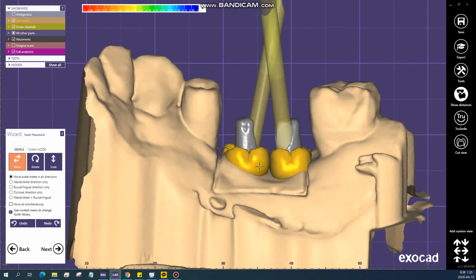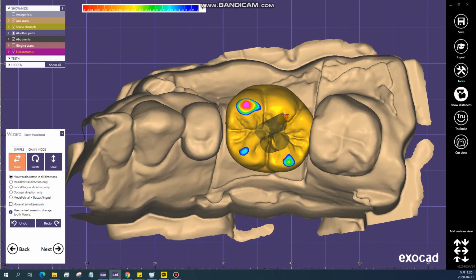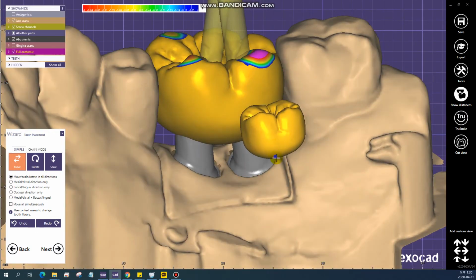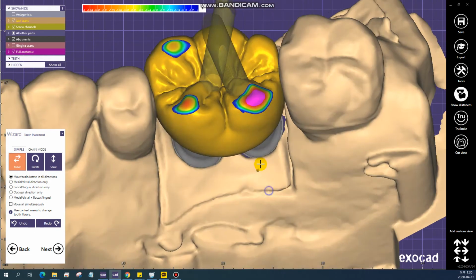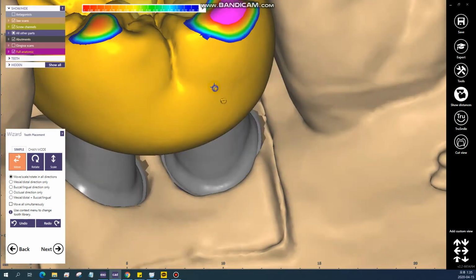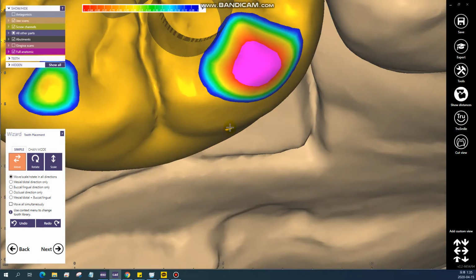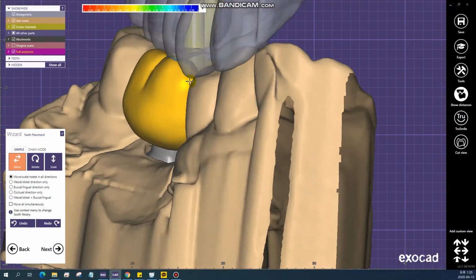Okay, here's the important part. This one, number 30, is what I really need to design, and here's the unnecessary part, number 31. And now you can see it's really tiny and in contact with number 31. After doing that, when positioning everything, you have to put it like that.